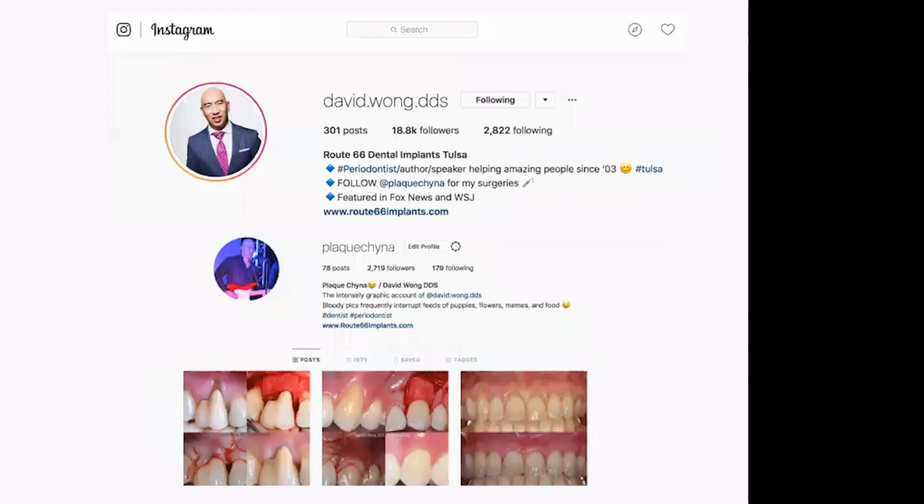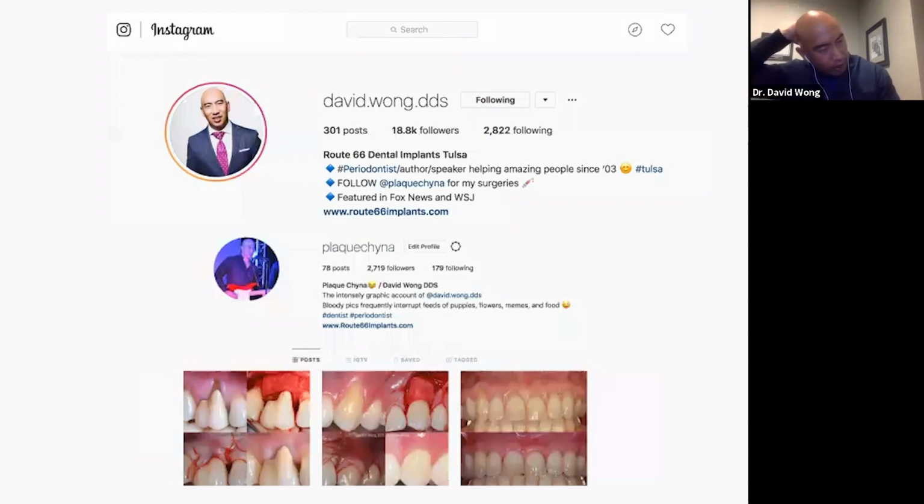Do you believe there are certain implant designs or surface treatments that are superior to another when it comes to resisting peri-implantitis or lack of stability? Well, historically, the hydroxyapatite surface is the one that's associated the most with rapid breakdown and more aggressive peri-implantitis, because it's an actual coating, right? Nowadays, most implant companies don't coat their implants; they're etched or treated. So there's really not a whole lot of difference from one surface to the next.